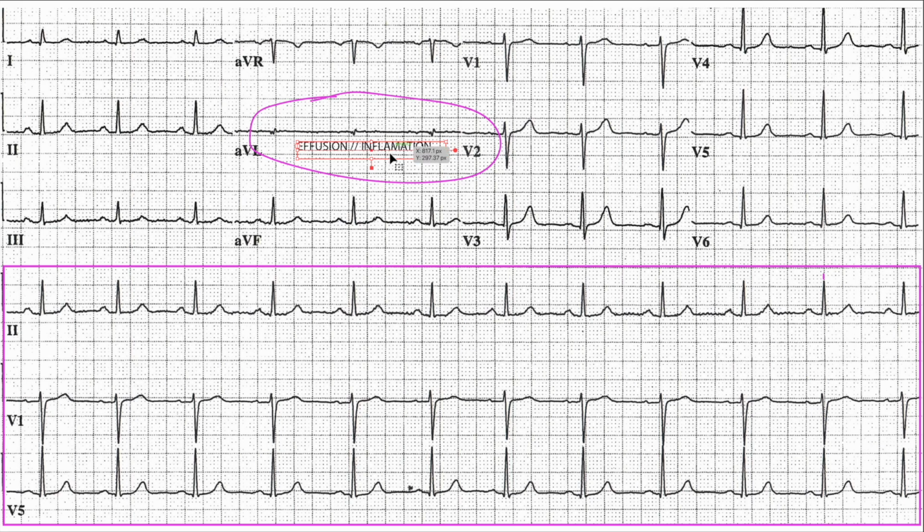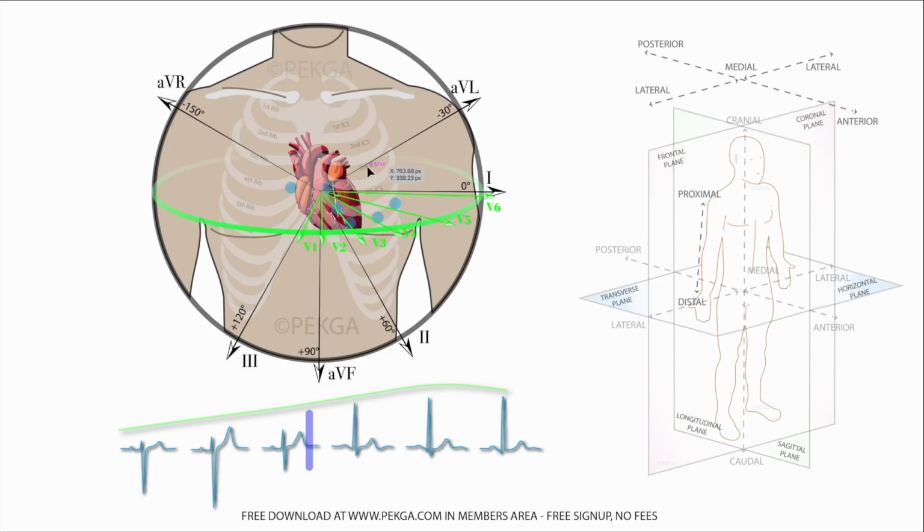you might have some inflammation or effusion happening around the heart or around the lungs. And what is going on there is, if you can see this here, imagine if you had some sort of a buildup around the heart or perhaps in the lungs.